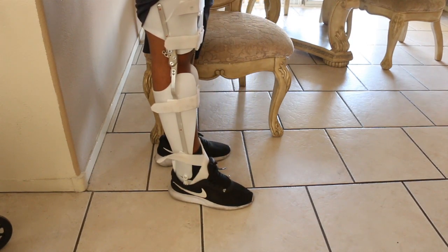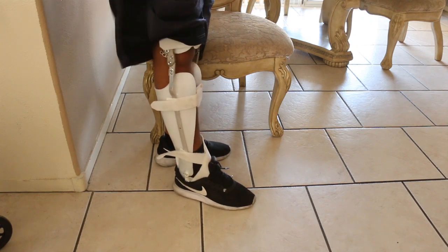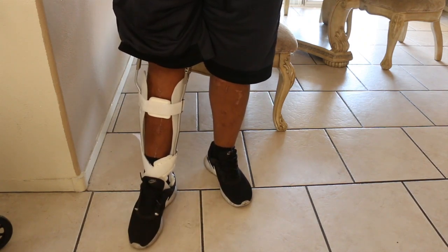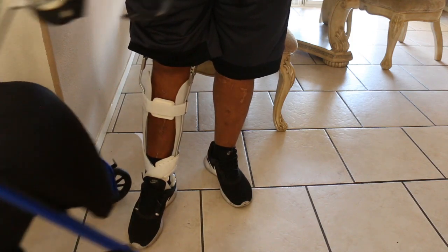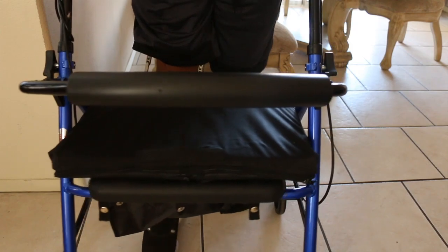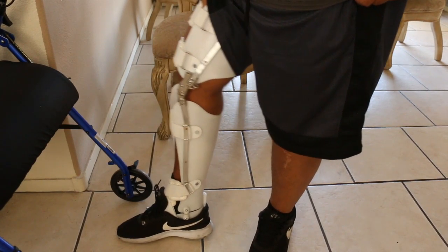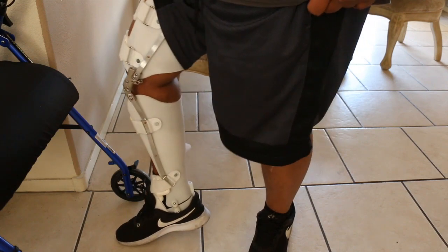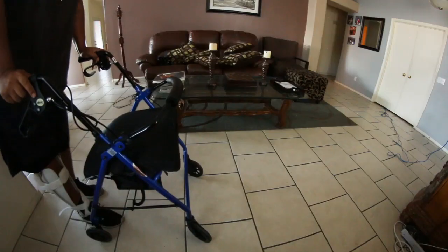Now the weird thing about this brace — I'm not sure if it's just my luck — but the hinges on this brace, the screws have come apart. The screws got loose and fell out while I was using it once, and that scared the crap out of me because if I had taken another step, the thing would have just shattered and I would have fallen. Pretty scary. Anyway, I'll show you my walking in it.